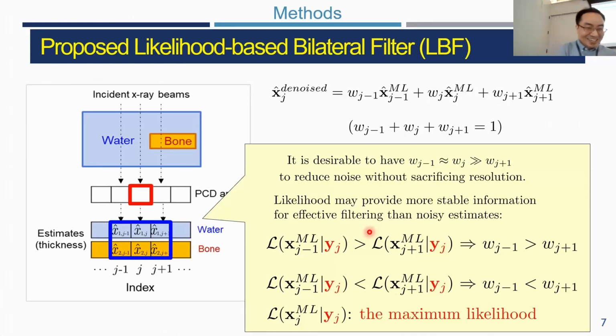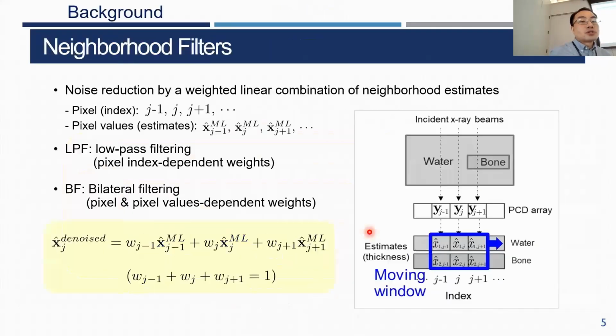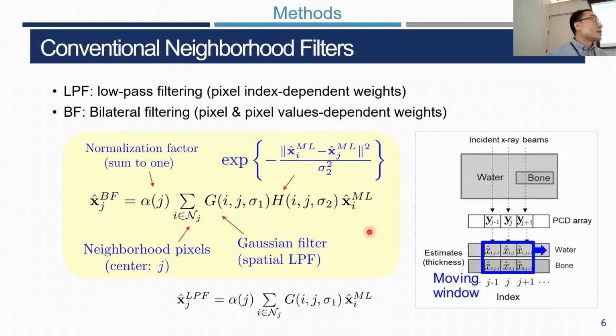Also, one more question. Why are you doing the filtering in the sinogram domain as opposed to the original transmission domain? Because when you go to the sinogram domain, you have crosstalk between the two basis functions. So your question is why I applied the filtering in the basis sinogram rather than the energy-wise projection?